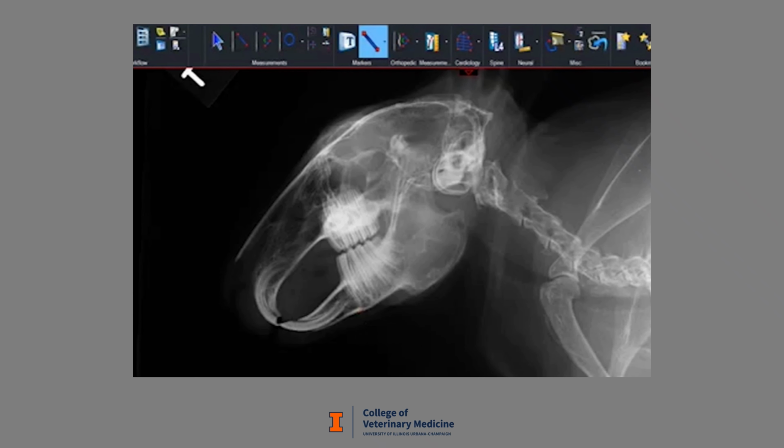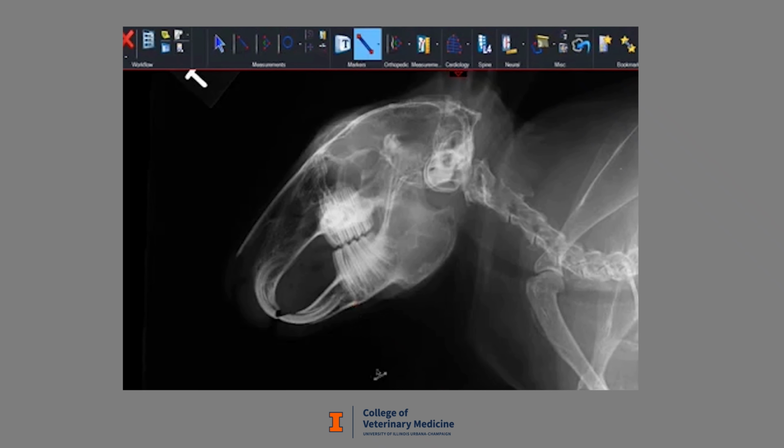Once well-positioned diagnostic radiographs have been obtained, we can apply objective anatomical reference lines as defined by Bomer and Crosley to the images to diagnose and monitor acquired dental disease in domestic rabbits. On the lateral view, our first anatomical reference line is drawn parallel to the ventral mandible. The apices of the mandibular premolars and first molar should be parallel and not penetrate the ventral mandibular cortex. In this case, there is no retrograde elongation of the mandibular teeth.